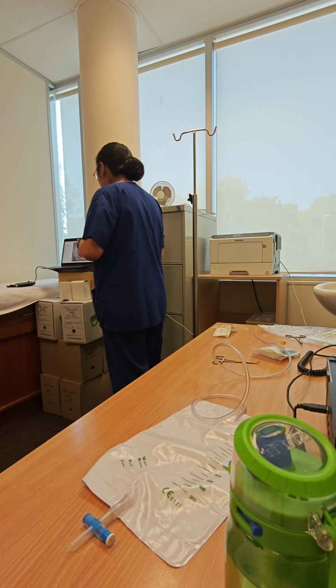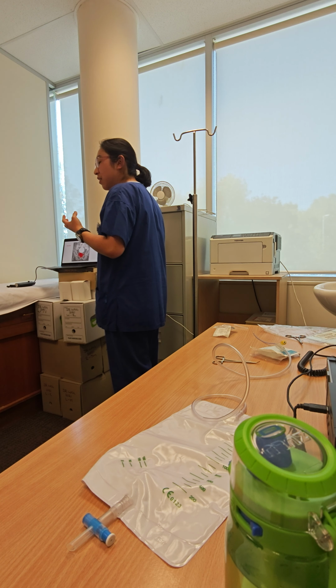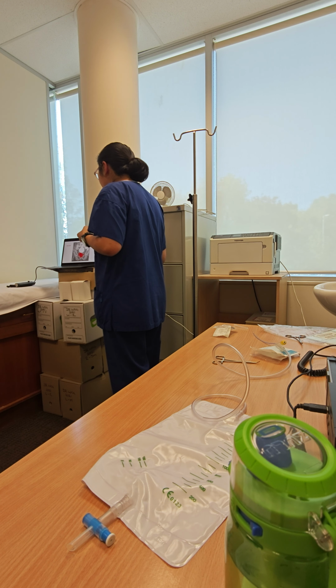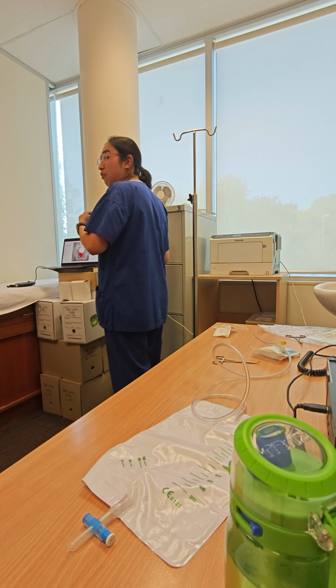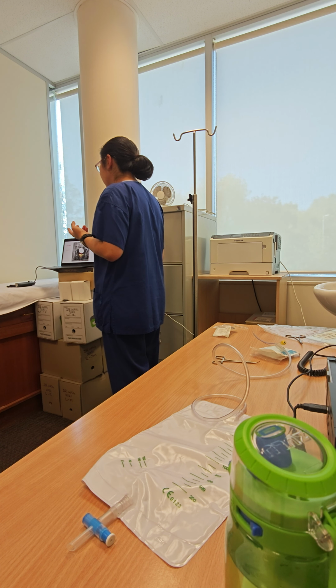This patient came in and had the cystogram. You can see the round bright circle is actually his bladder. It's full of the contrast dye. And then we can see another bright spot, which I use the arrow to highlight. It's the leak of contrast. Let's have a look at what happened two weeks later.